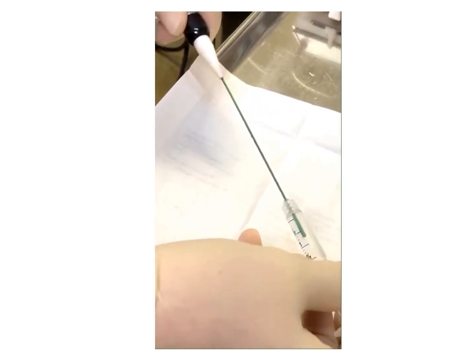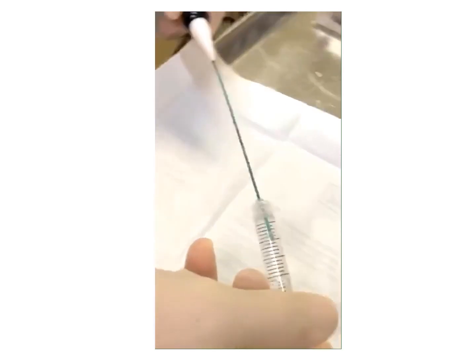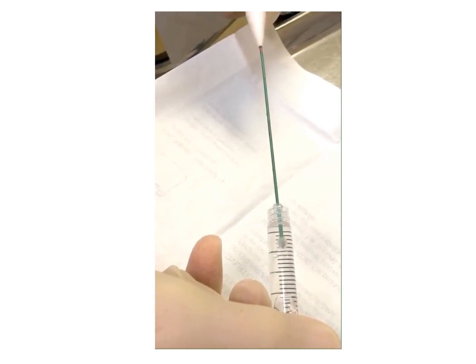Here we demonstrate the formation of the ice ball in a normal saline syringe. The ice ball begins to form immediately after the gas is turned on and will grow in size. As soon as the gas is turned off, the ice ball will shrink and can be removed through the skin.